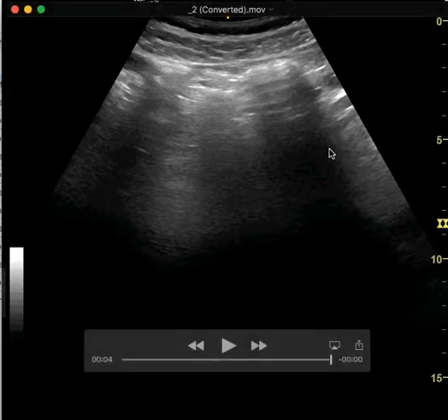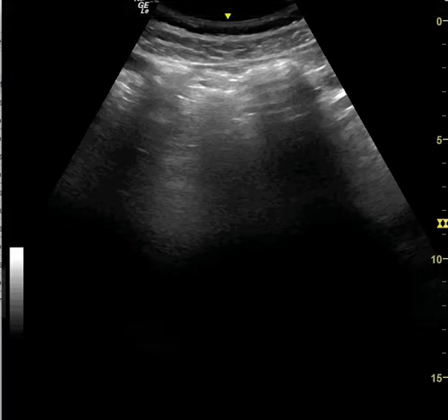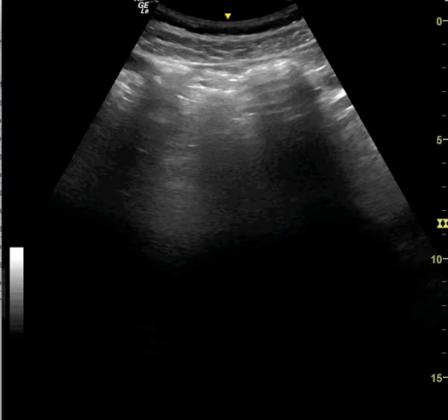What I mean by that: you have the probe with the indicator pointing to the patient's head in long axis, moving it left to right. You're then going to turn the probe 90 degrees so the indicator is now on the patient's right, and move it up and down to get multiple planes.